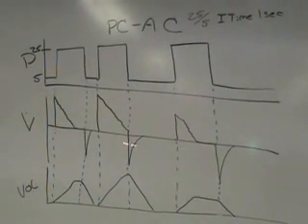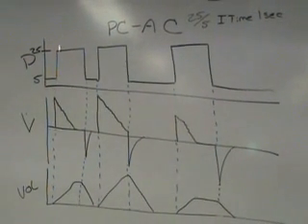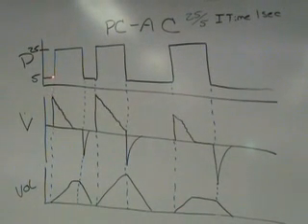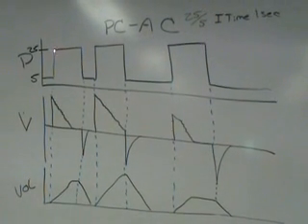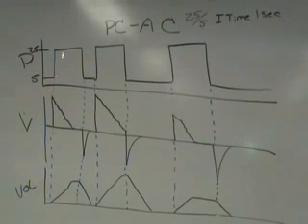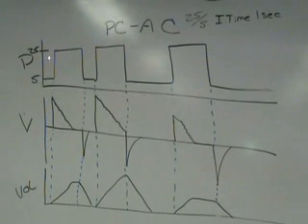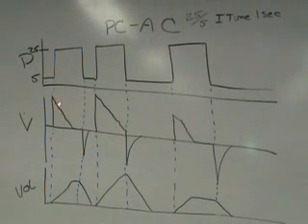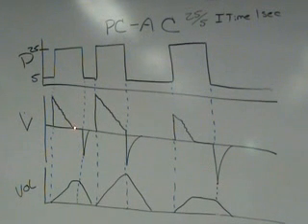If I look at the flow time scalar at the same time, you see that the beginning of the flow rate begins with the beginning of the pressure change. Initially, I get a lot of flow because I have a big gradient between the pressure that's in my ventilator and the pressure that's in my lungs. As my lungs fill up to this pressure, which I can't really see by looking at these graphics, but I can understand it in theory, as my lung pressure increases to the set pressure, the flow between those 2 points decelerates. At this point in my flow time scalar, I see that the flow is at 0.